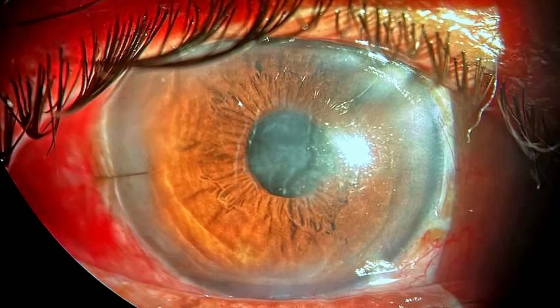And these are the post-op pictures. For the first week, the cornea was edematous and gradually it improved. The lens continues to be stable and well centered.